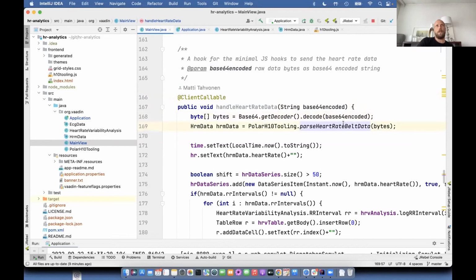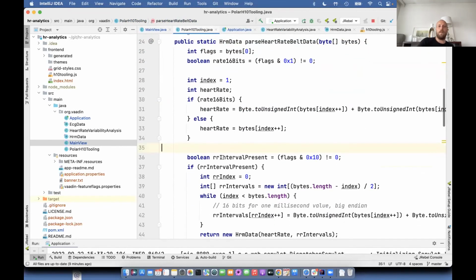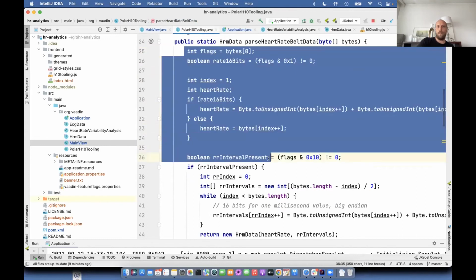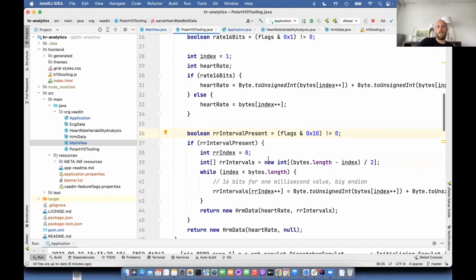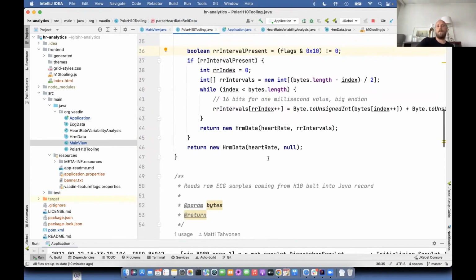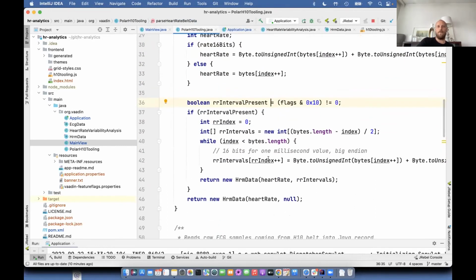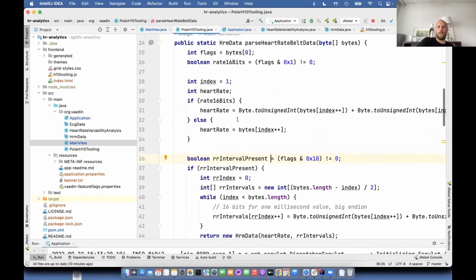And after that, everything is pretty easy. So this is the tooling that I built, and everything here is basically just plain Java. Now it's easy for a Java developer to get the byte array, get all the byte flags, and read the values there. Well, it would be difficult unless you knew what the data consists of, but for that, the Android toolkit was actually really helpful. So that's why it was pretty easy to write this method.